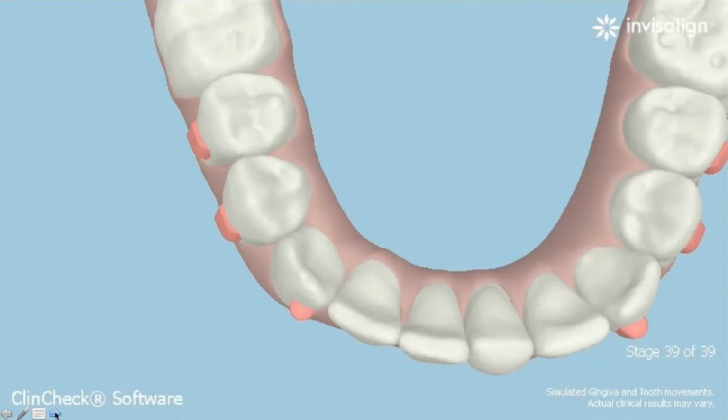Most of the time when I ask for 30 degrees, which is my favorite amount of overcorrection or rotation, it doesn't actually go 30 degrees. It might only go 5 degrees. But that's why it's so useful, because if I had no overcorrection, it wouldn't have made its full rotation, and it would have stopped short of where it was supposed to go.